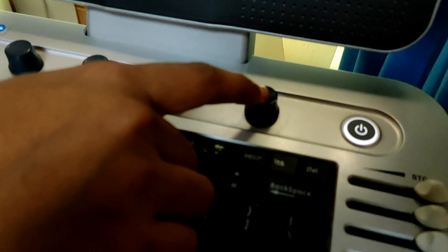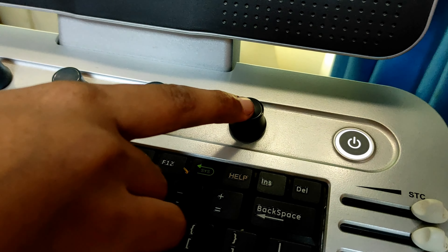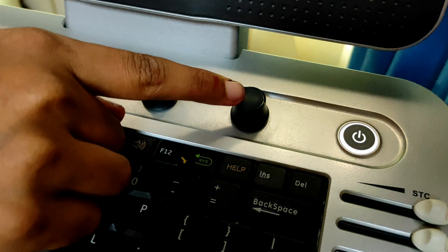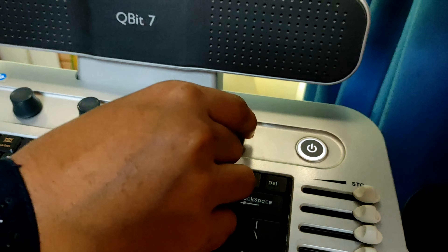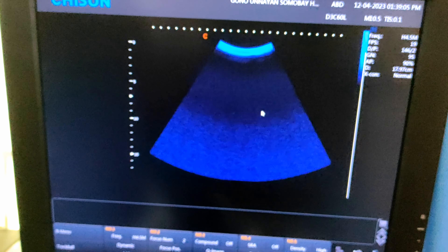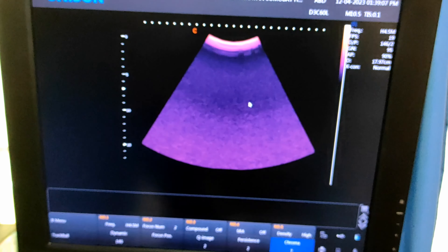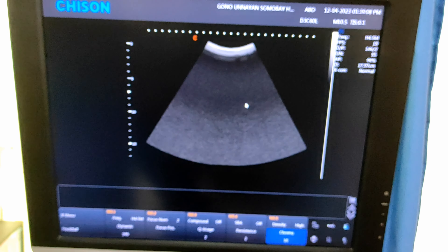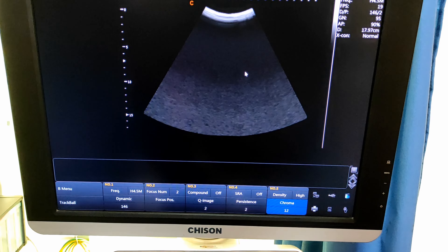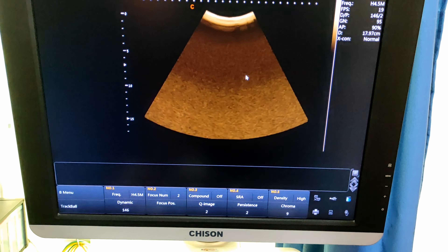Now this button, which is next to your power button, is used to increase or decrease the gain, or to adjust your screen image color for your color print. Now rotate it and see — the chroma value is changing.